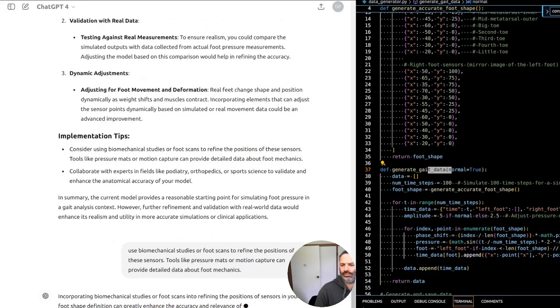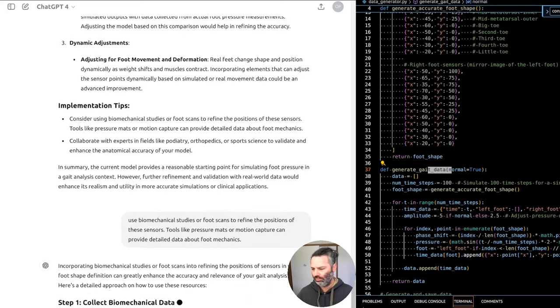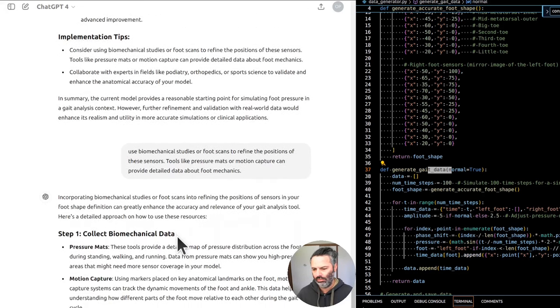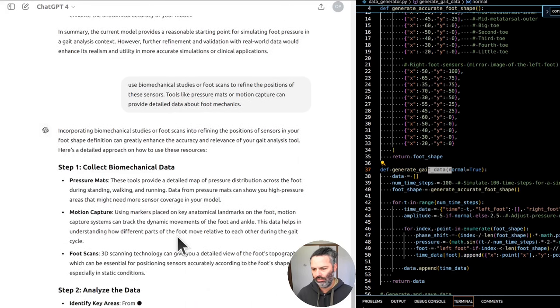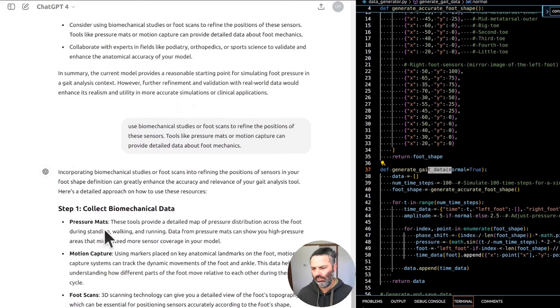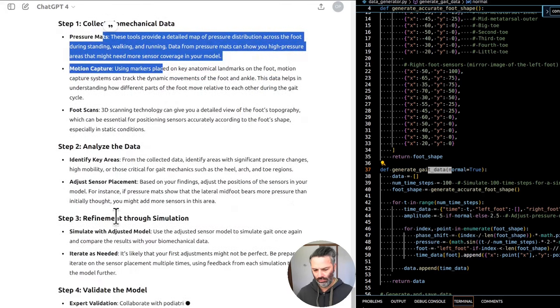2. Symmetry and distribution. The script provides a mirrored layout for the left and right foot, which is anatomically appropriate given the bilateral symmetry of human feet. The distribution of points covers critical areas that typically bear more weight and are subject to pressure changes during walking.